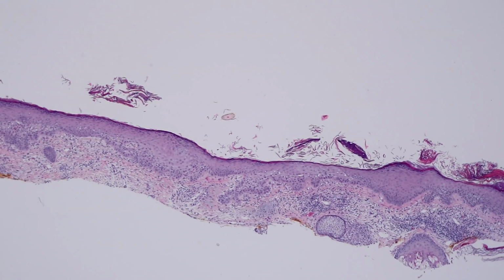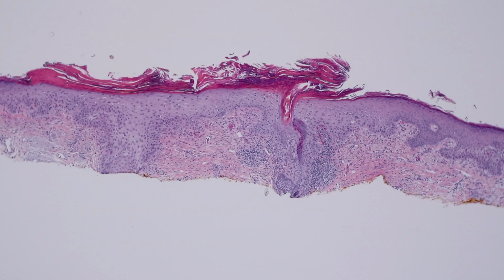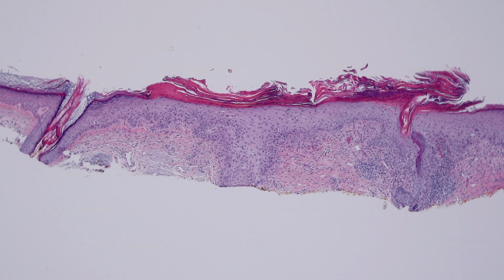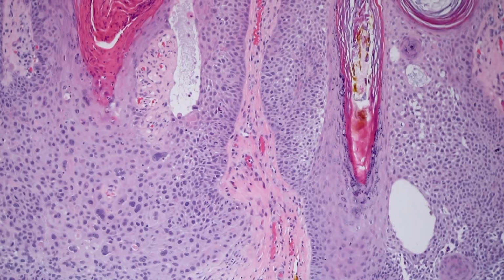Now out here, we have actinic keratosis. Atypia along the basal layer, but maturation at the top. There it gets a little bit harder to tell. It's pushing down follicles, but still seems to mature, so I would still say that's probably actinic keratosis. Here, we're really getting filling of most of the epidermis with some pagetoid spread. I'd call this squamous cell carcinoma in situ. And then now look what's happening.